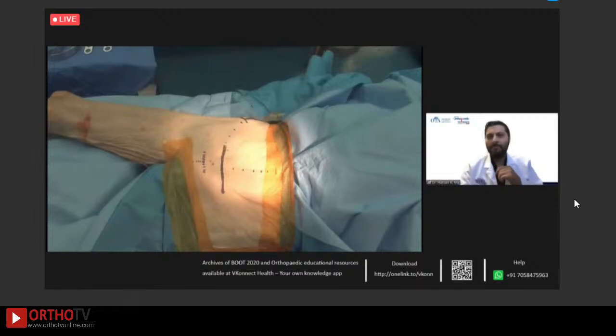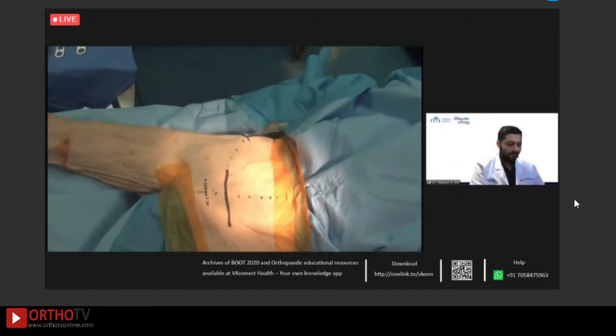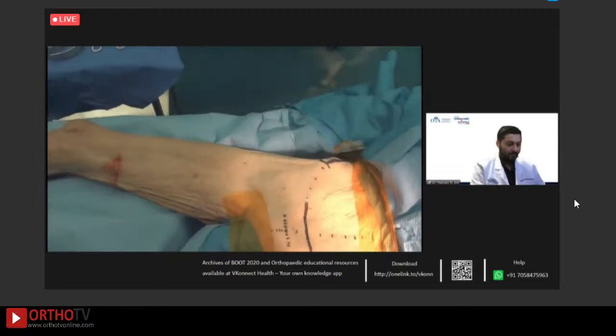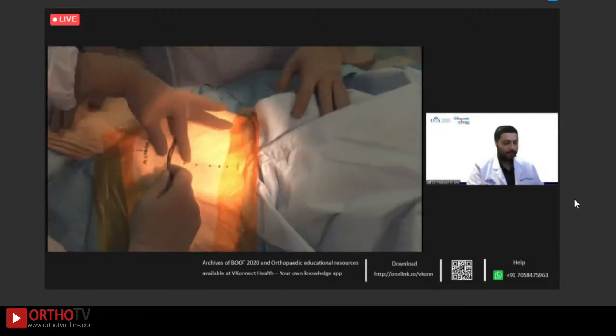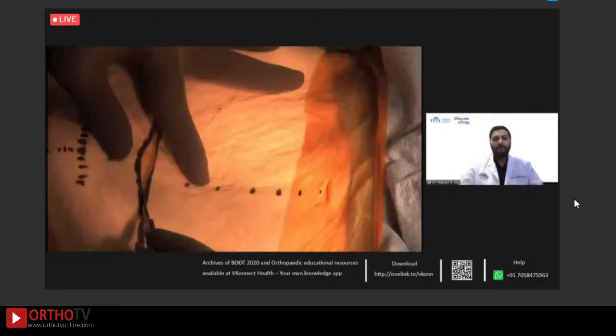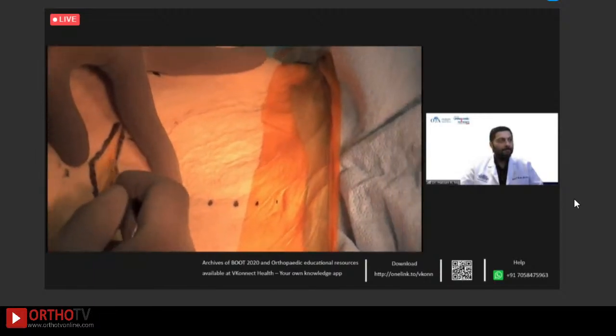So now the AIP. This is a video demonstration of a modified Stoppa approach for intrapelvic exposure. The patient is supine with a bump under the ipsilateral thigh to relax the iliacus and psoas muscles. The incision is a standard 12-centimeter Pfannenstiel incision, approximately 2 centimeters proximal to the symphysis. The lateral window can be added in cases that necessitate that exposure.